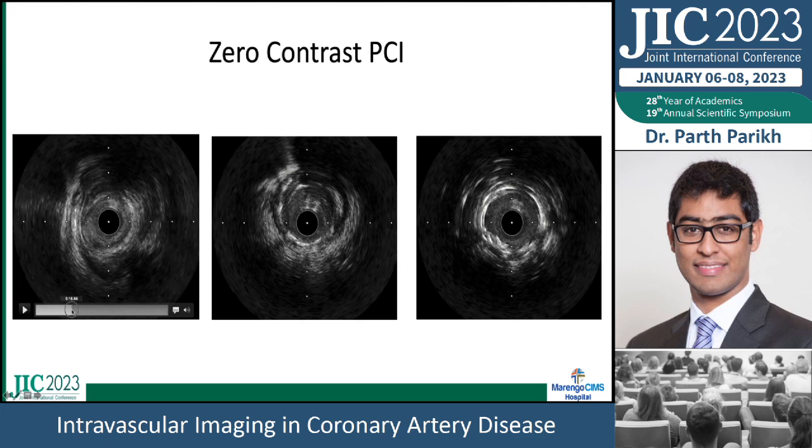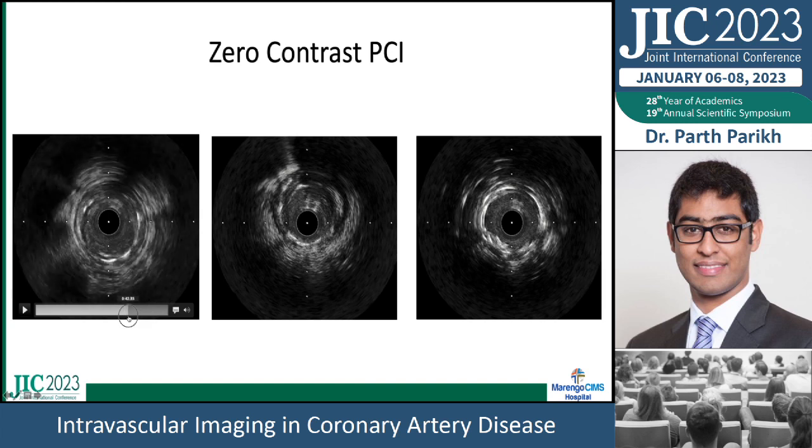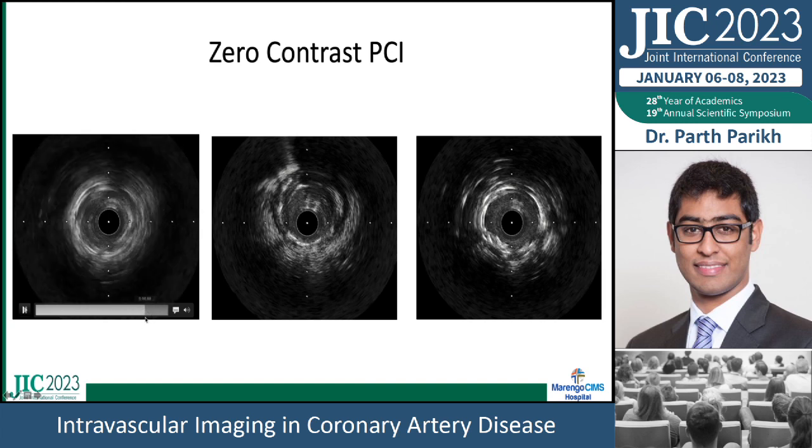Again, as opposed to the first case where you saw, you can see beyond, so there's not significant calcification. So this helped us know that we don't really need to modify the vessel as much. And then again, coming up here, there are multiple layers of stents.